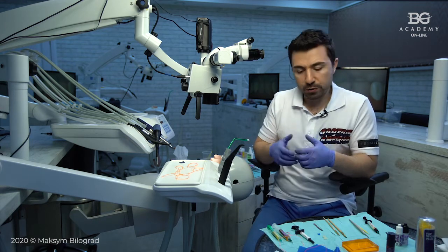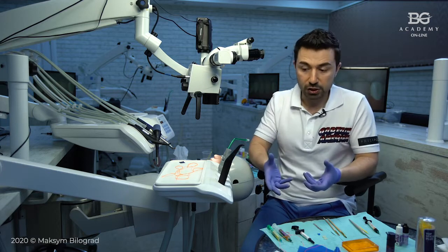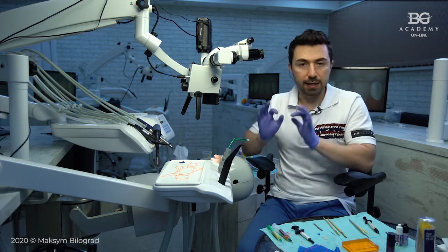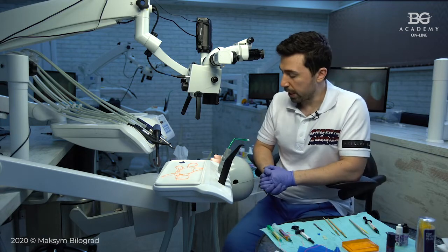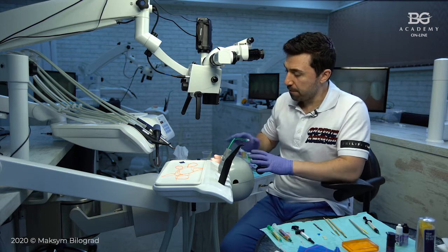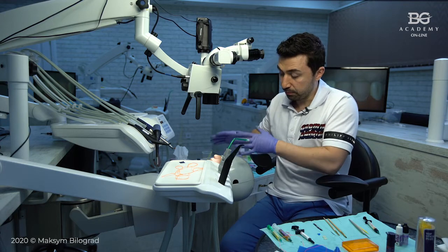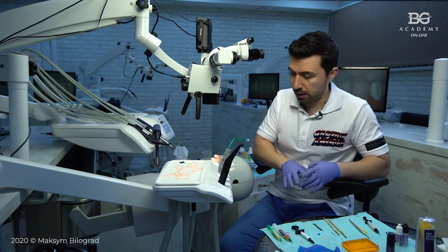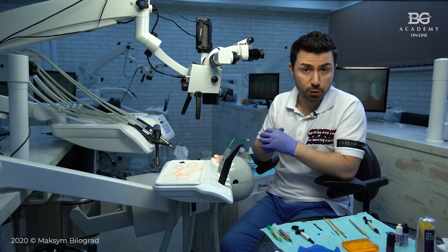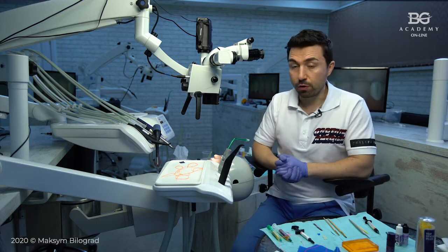Personally, I prefer the second scenario, when I have these veneers and then I or my assistant can prepare them in advance, and then I have my patient, they make the try-in, and then I make the bonding procedures. Okay. What else? If we do this scenario like here in the class, we just make the try-in before any preparation, and then the patient can stay without provisionals for a few minutes, and you will prepare your ceramic for cementation.